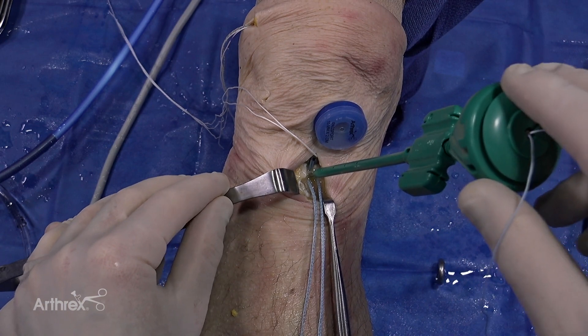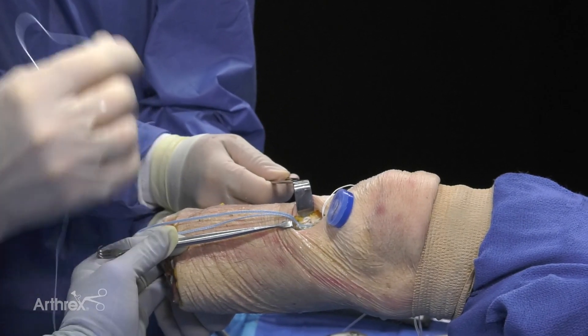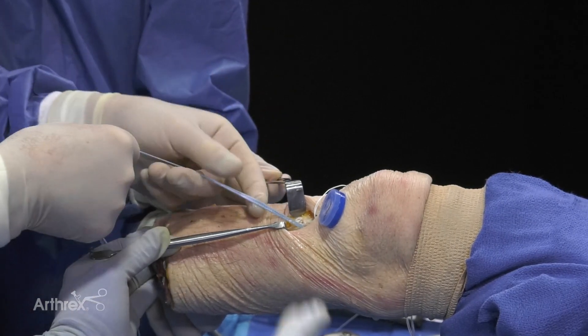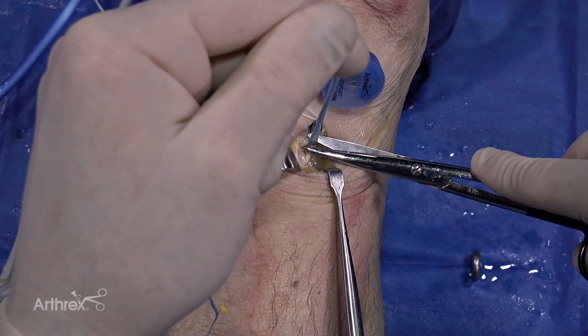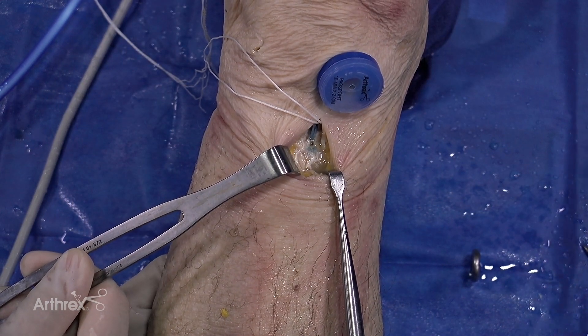Looks like I'm perfect right at the cortex. At this point I do not need the suture that was in the swivel lock. The tapes are fixed — I can cut the tapes. Internal brace is done. Now we need to fix the graft, because I haven't fully tightened the tibia.